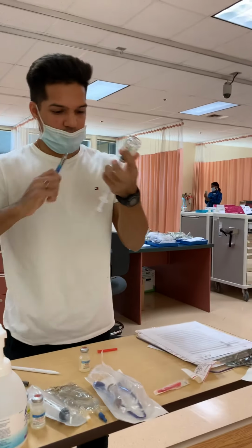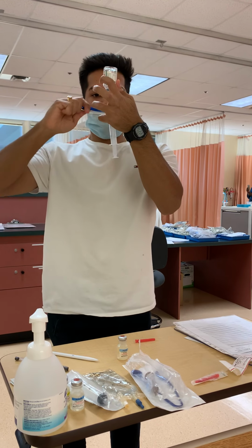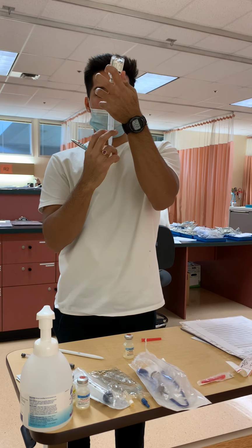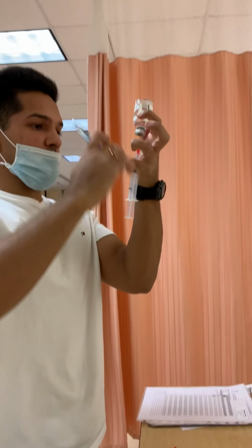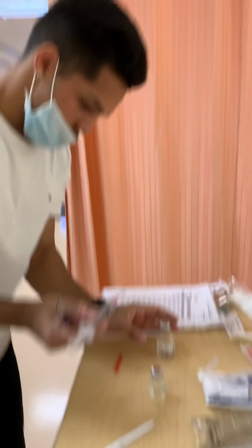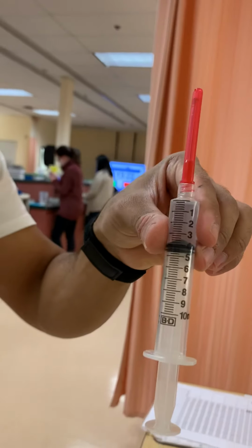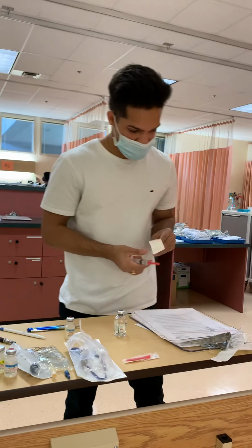Okay, I'm just going to be getting rid of all the bubbles. Okay, I'm going to be scooping that. Here you can see I have 4 mLs of medication, no bubbles. Okay, so I'm just going to do my second check. Over here I have my tag already made.